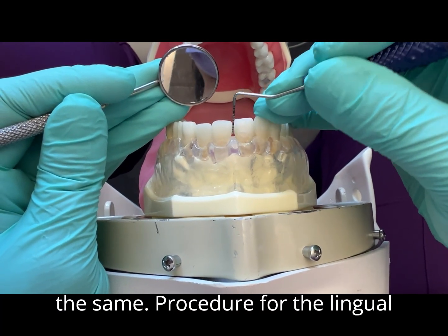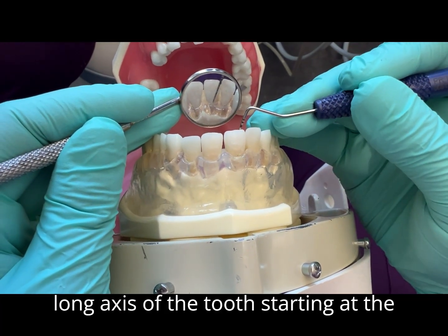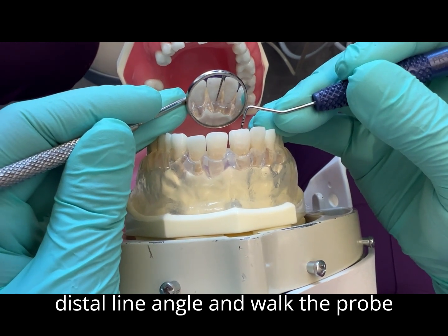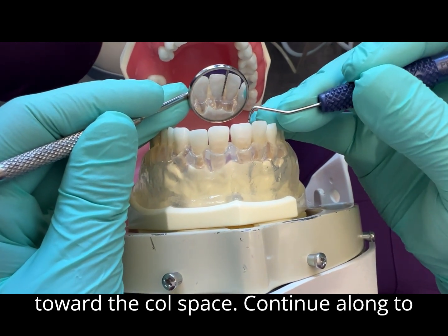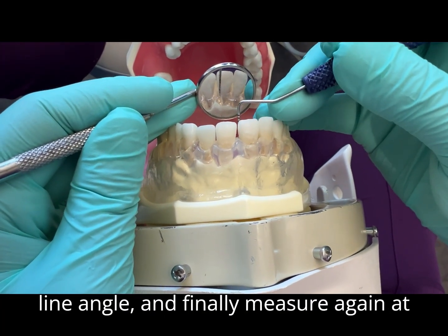Now we'll do the same procedure for the lingual surface. Insert the probe parallel to the long axis of the tooth starting at the distal line angle, and walk the probe toward the col space. Continue along to the midlingual, then toward the mesial line angle, and finally measure again at the col space on the mesial.